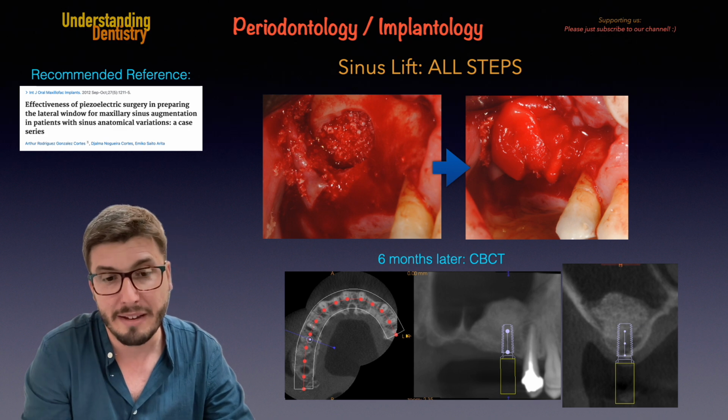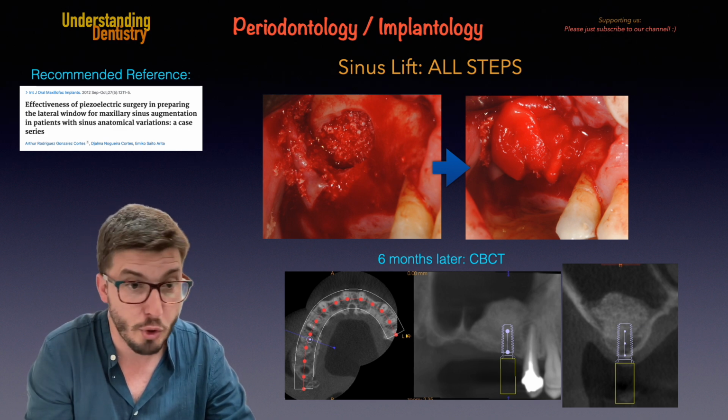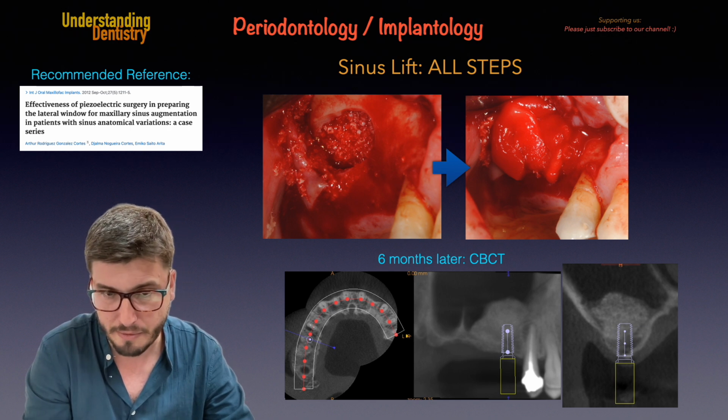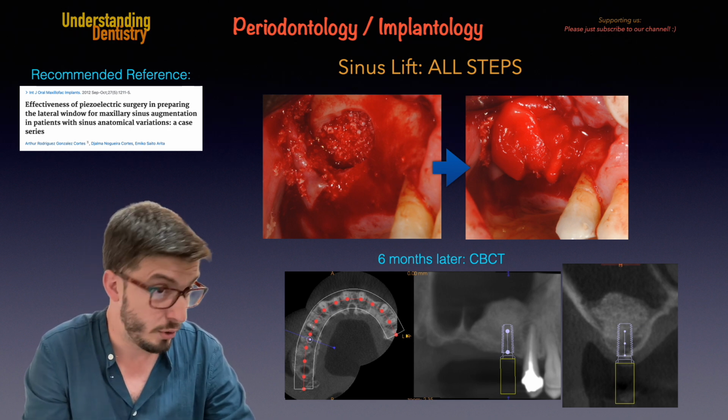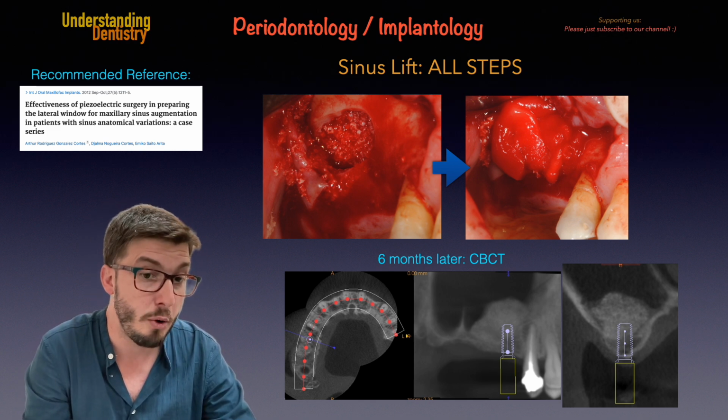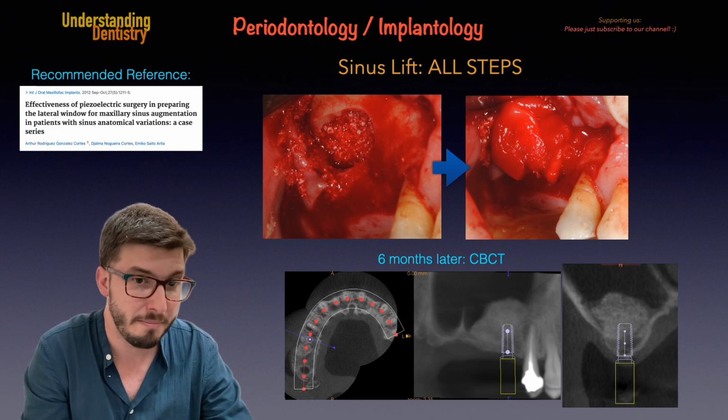Okay, now in the middle you have the coronal panoramic window, showing that the lesion is still healing, for example, of the premolar, or not. So we are following up the situation, of course, but our graft is still there, away from the septum. Take a look at the septum, okay?